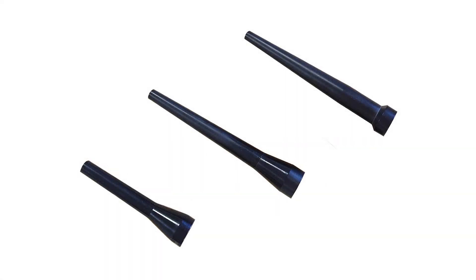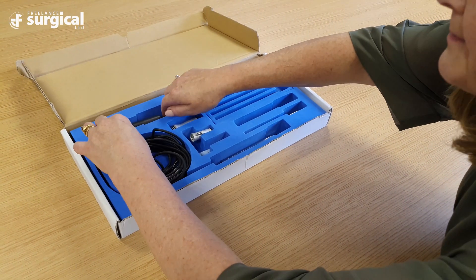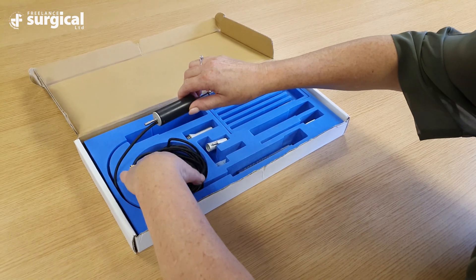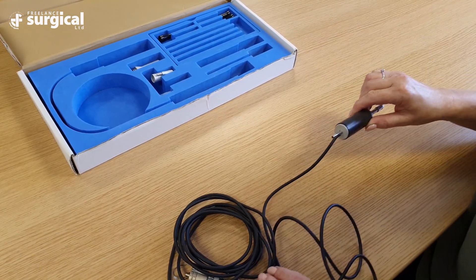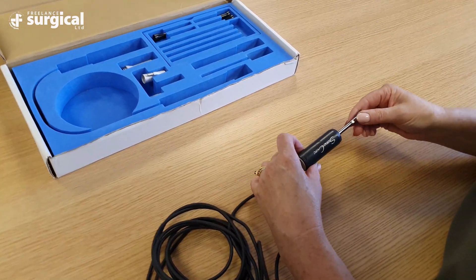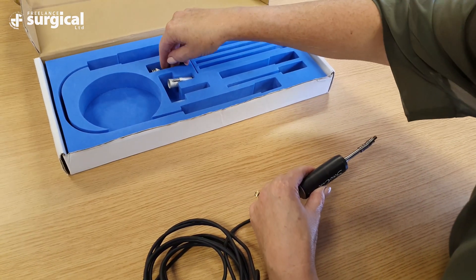Each tip has its own corresponding guard. It's essential that the surgeons select the correct tip and guard together for the surgery. Remove the handpiece carefully from the packaging and attach the large silver guard onto the handpiece and push it into place with a positive pressure.